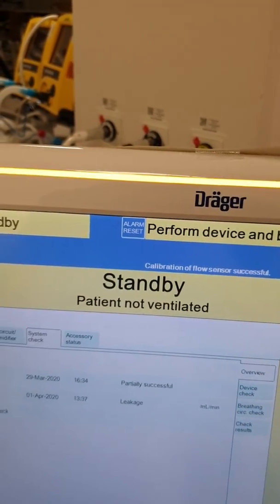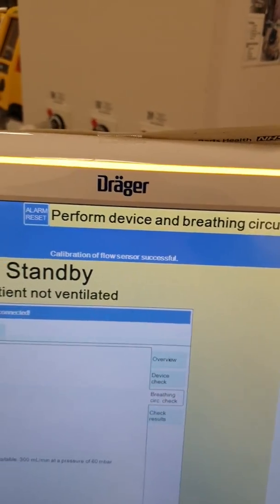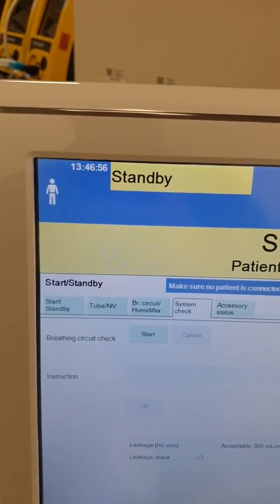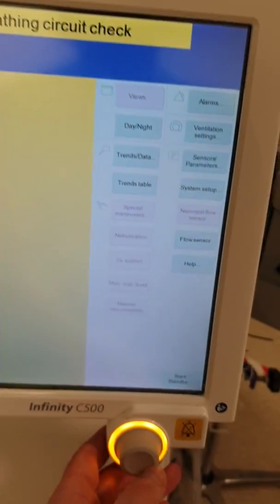The only thing left for you to do now is to do a breathing circuit check. So we're going to go over here and just follow the instructions on the screen. It says breathing circuit check — please start. Press start. You need to confirm here on the knob.